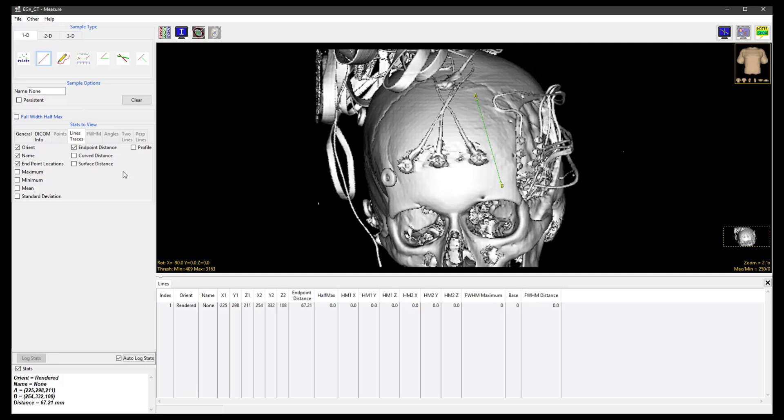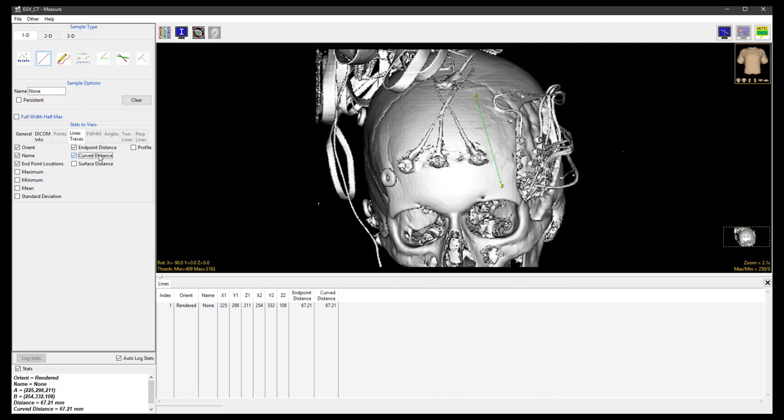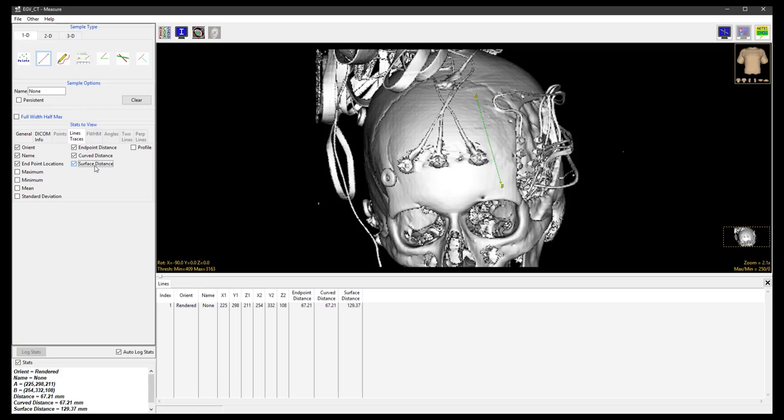Now check the Curve Distance and Surface Distance checkboxes in the Stats to View Lines Traces panel. No curved line has been defined here so the Endpoint Distance and Curve Distance are the same, but the Surface Distance, which is the defined line projected onto the surface of the rendering, is a larger distance as would be expected.